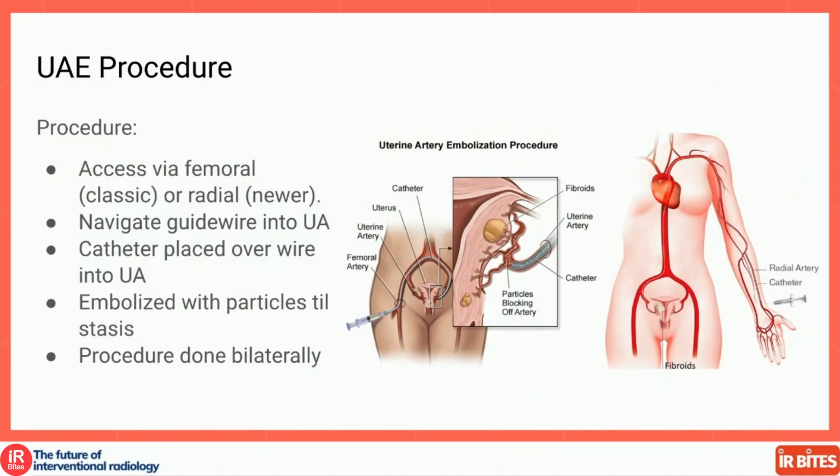So you might be able to do it as a day case if you do radially. And also the benefit of radial access is the patients can get up early, whereas if they've got femoral access, they have to lie down for a bit of time, because otherwise it risks access site problems.